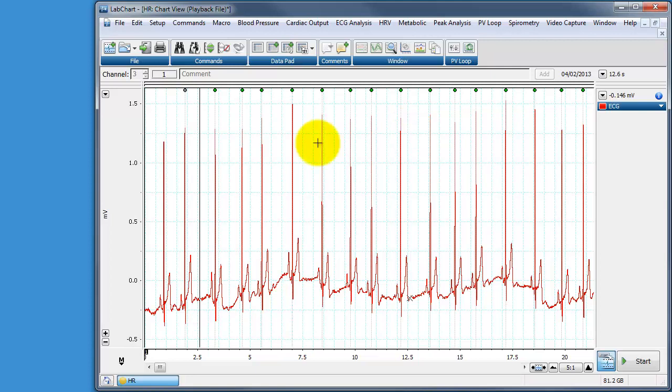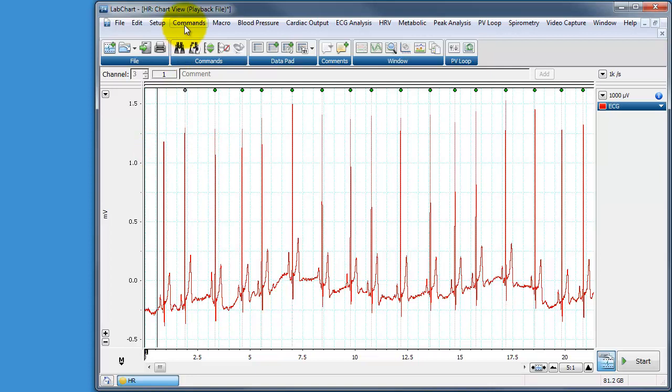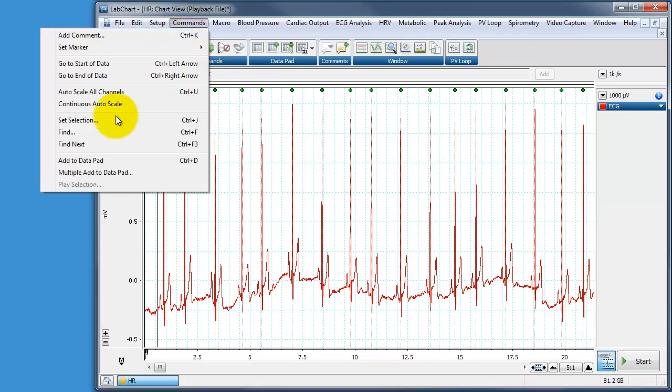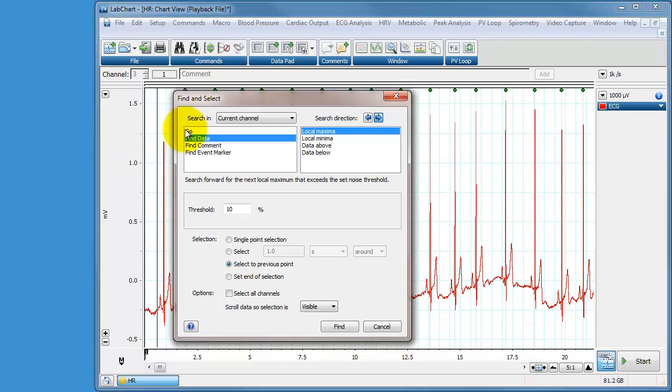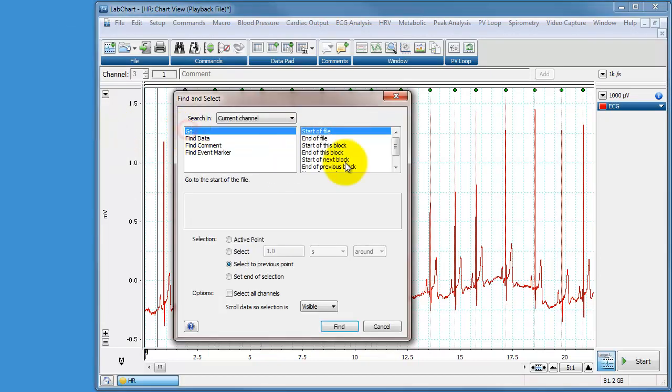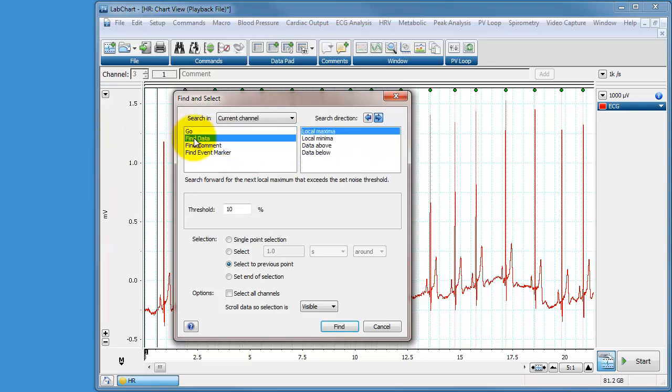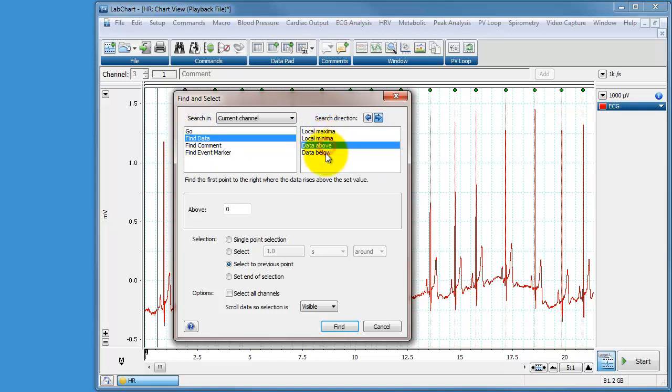So first of all let's just look at the different commands we've got. We've got a find command in the command menu and the find command is quite clever. It allows us to look for various things, it allows us to look for comments, event markers but one of the functionality is to look for data. And for instance here we can look for maxima, minima, data above or data below.